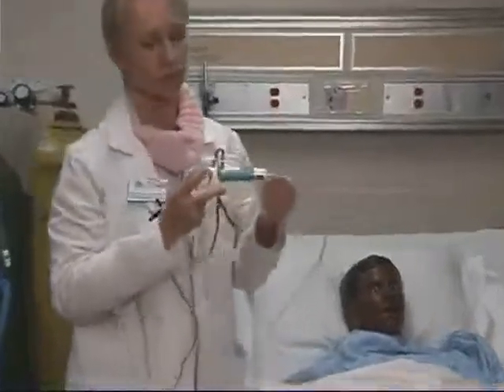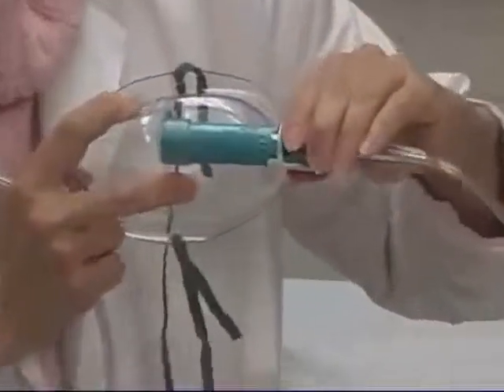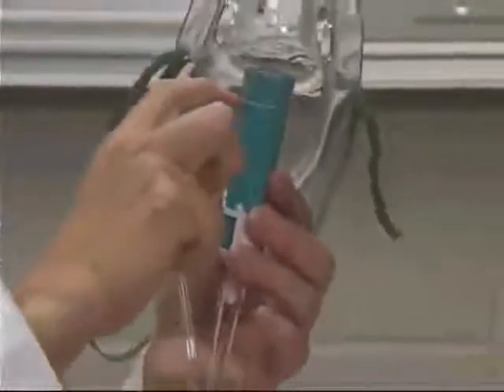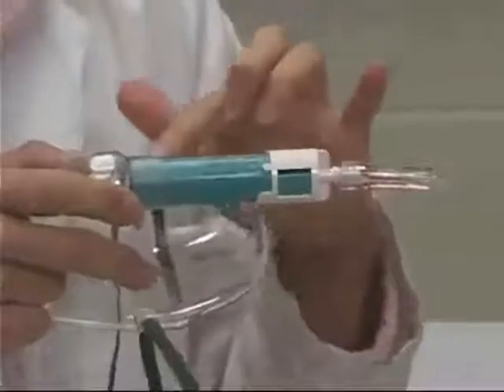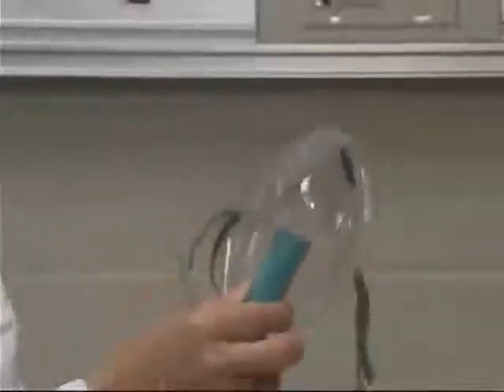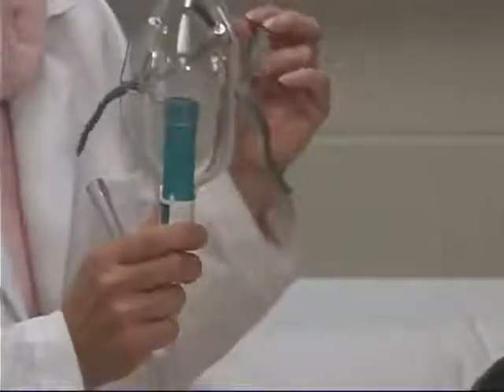So on this particular type, you can see this is an example where the exact liter flow, by turning this dial, not by the flow meter, corresponds to an exact amount of oxygen delivered, and it's controlled through how this device works internally. Versus having this mask hooked up directly only to the flow meter, you have this extra piece that will act as a device to give you the exact flow of oxygen to the patient. And this is put on the patient the same way as the other masks, and it's hooked up to the oxygen source in the same way. And that ends my demonstration on a Venturi mask.